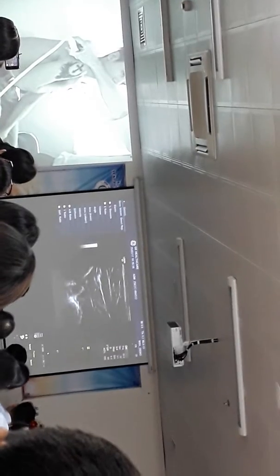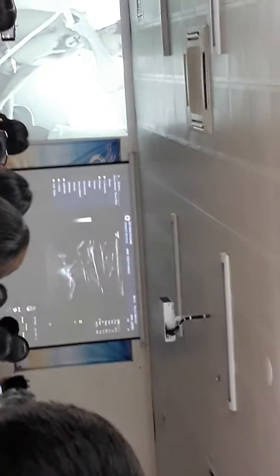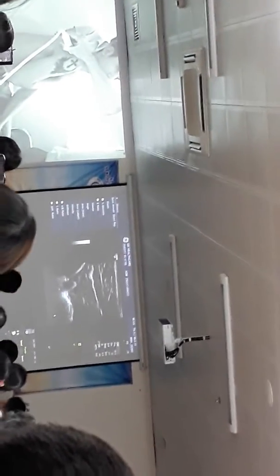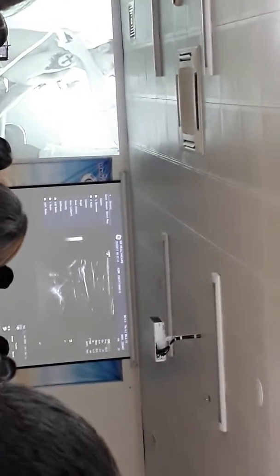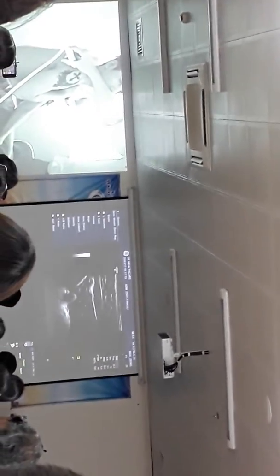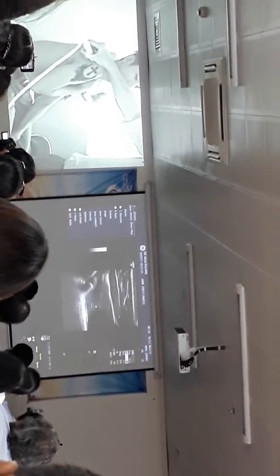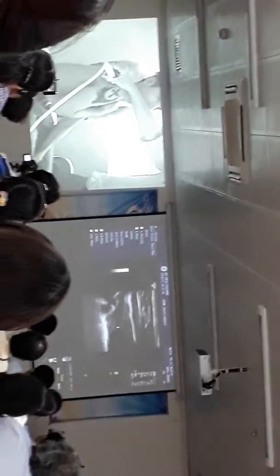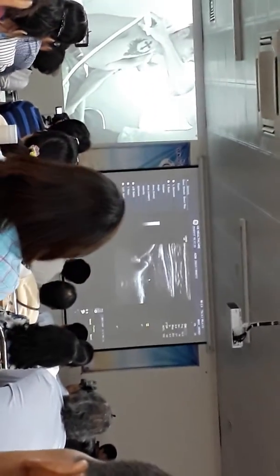In this area, in the setting of labral tears, we can get a ganglion that pushes into this area and causes neural compression on that nerve. And that nerve supplies the infraspinatus muscle and also the supraspinatus muscle.